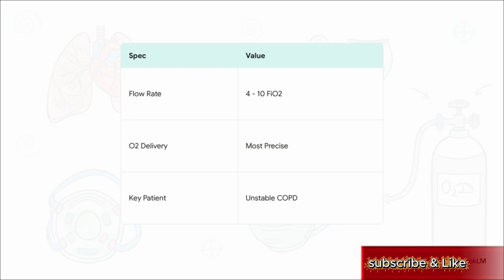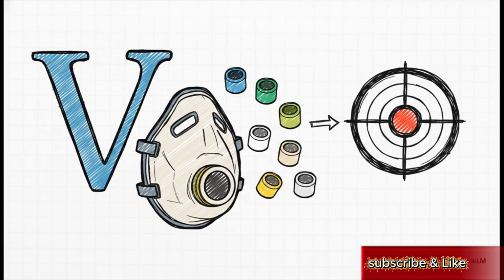Next up, we have what I like to call the sniper rifle of oxygen delivery, the Venturi mask. Its superpower is its incredible precision. It can deliver an exact, pinpoint-accurate concentration of oxygen. And that's an absolute game changer for a very specific group of patients, those with unstable COPD. So why is this precision so ridiculously important for our COPD patients? Well, for them, too much oxygen can actually be a really bad thing. It can literally knock out their natural drive to breathe. So we have to be like Goldilocks and find the amount of oxygen that is just right. And the Venturi mask is pretty much the only tool that can give us that level of control. So remember, V is for Venturi, and V is for very accurate oxygen delivery.